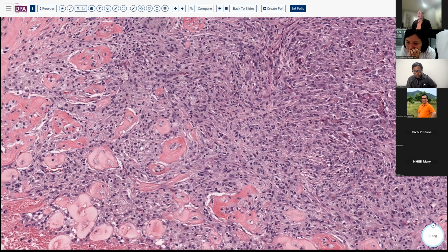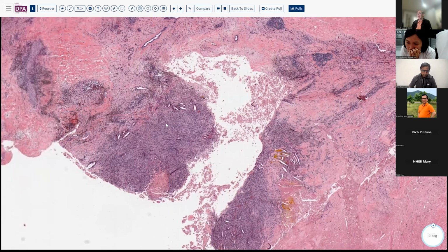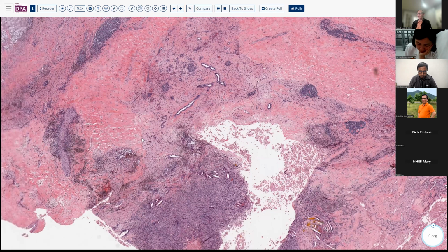And so in large respect, this tumor is one that tends to degenerate fairly readily in these circumstances. But when you see a lot of cholesterol clefts in this situation, you'd think, well, maybe granulomatous pancreatitis or something of that sort. But you do need to remember that solid pseudopapillary tumor can give you this appearance.